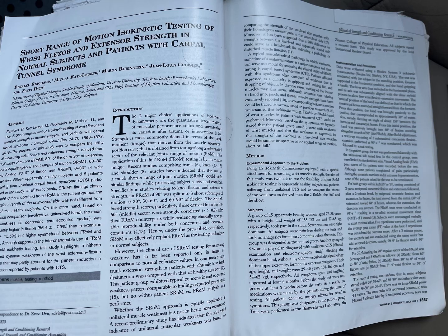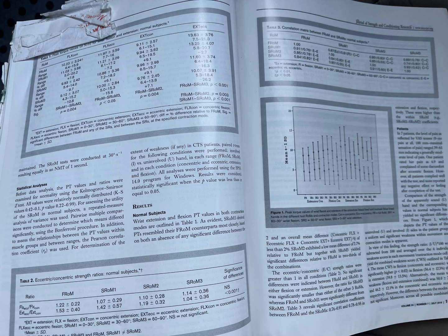The same order of 5 reciprocal concentric tests, followed 2 minutes later by 5 reciprocal eccentric tests, was maintained. The SRoM tests were conducted at 30 degrees a second, resulting equally in an NMT of 1 second.